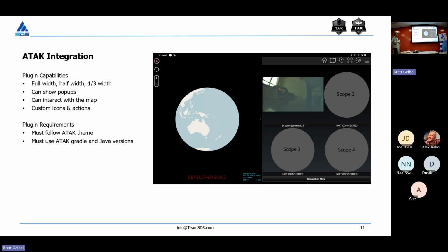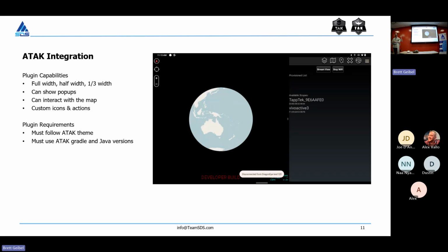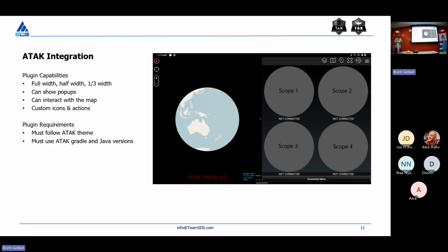And so as far as the capabilities, it basically allows you to do anything you can on a standalone application inside of this structure. And as Byron mentioned earlier with BATDOK, this is a user experience which people are used to using. So instead of having them switch between applications, instead of having them needing to learn a new UI, they're already working in something they are familiar with.